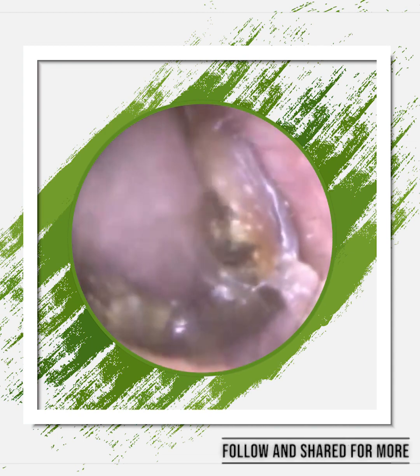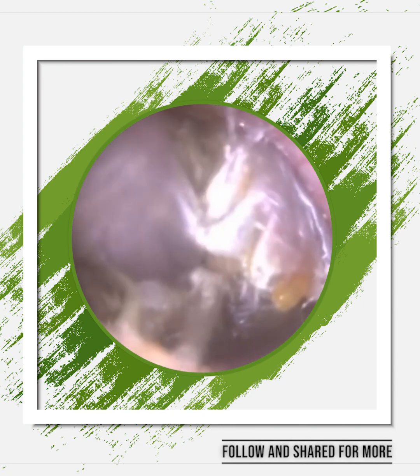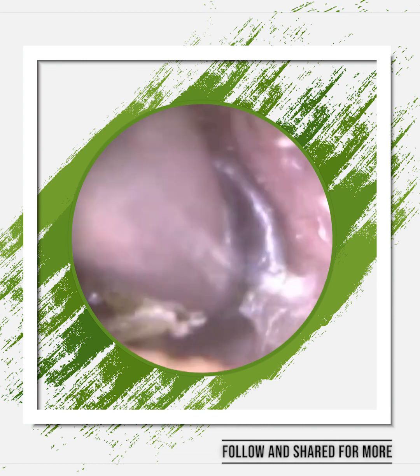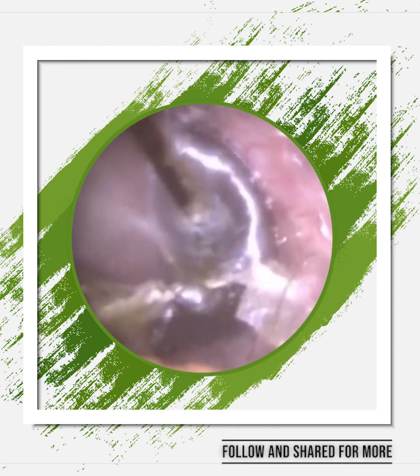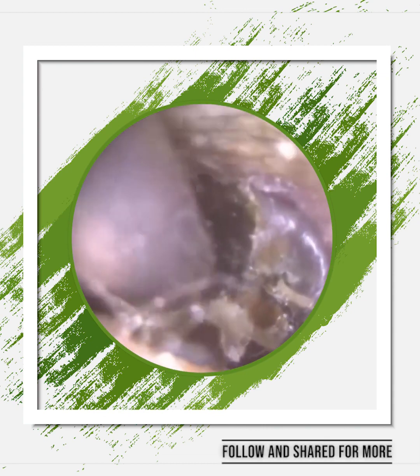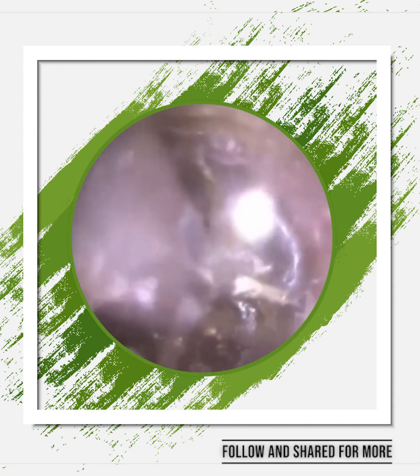We're just beyond the second bend now of the ear canal, and I know it's a second bend because it's the bony part of the ear canal and there's no hair follicles, there's no cilia on this part of the ear canal. In addition, there's a narrowing called the isthmus, so we all have two narrowings. The first narrowing is roughly 1 centimetre into the ear canal, and that's where the bony part of the ear canal meets the cartilage portion of the ear canal. And the second narrowing is approximately 0.5 centimetre away from the eardrum.